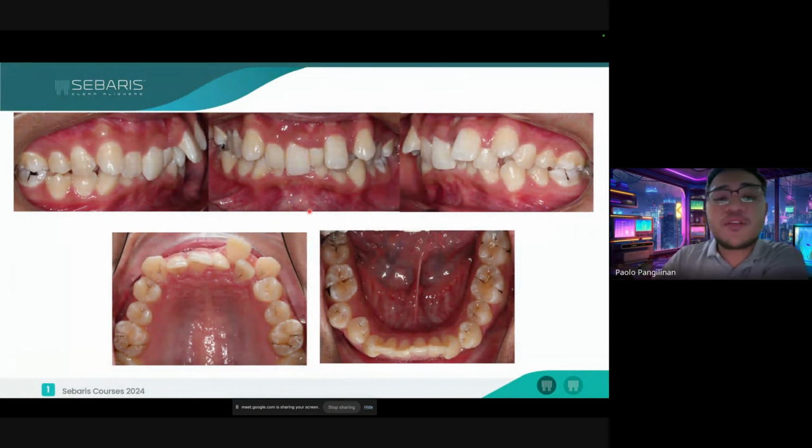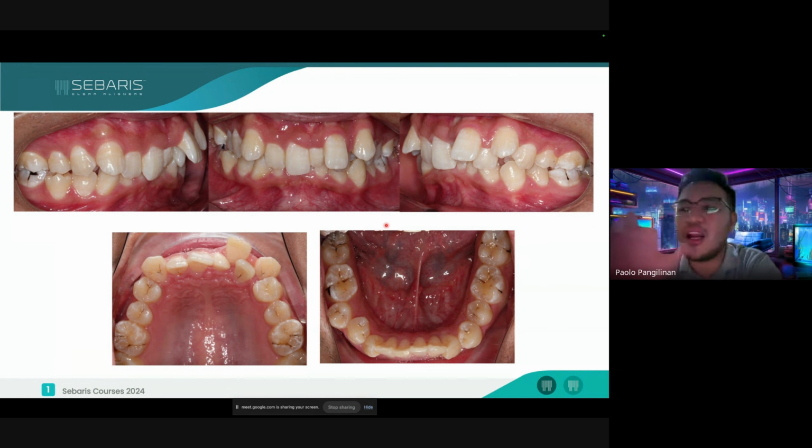So like in this case, for example, where we have an issue here. Without any knowledge for clear aligners, if you're going to stage this one without the knowledge of any deep bite staging or whatever staging that is, I think you can somehow break down how we are supposed to stage this one, or how we can improve the predictability of this one. I cannot just align everything and then everything is going to be finished. I cannot make it predictable. So basically my staging is something like this.